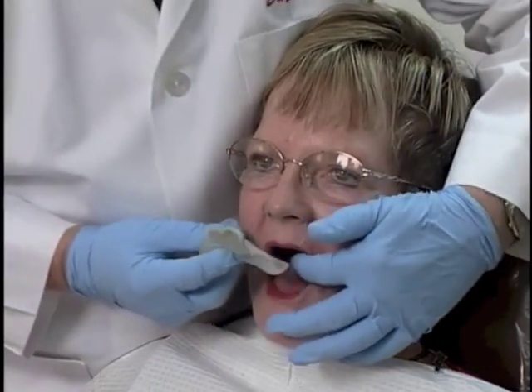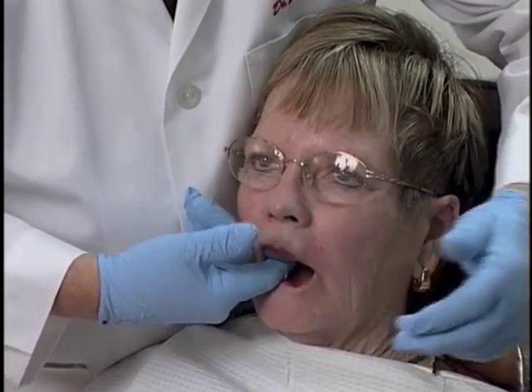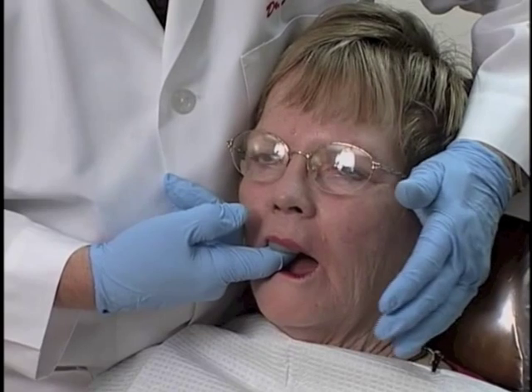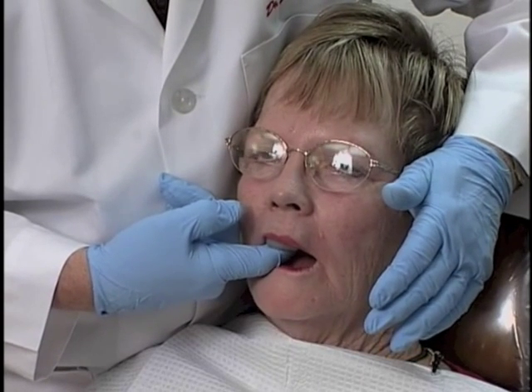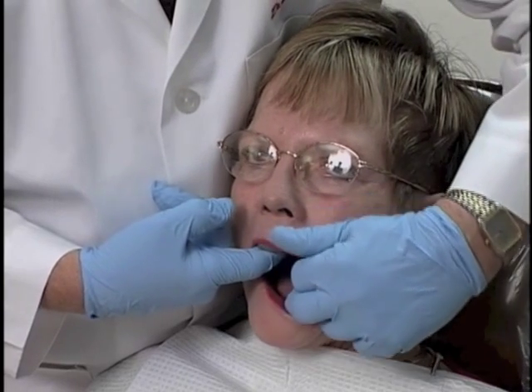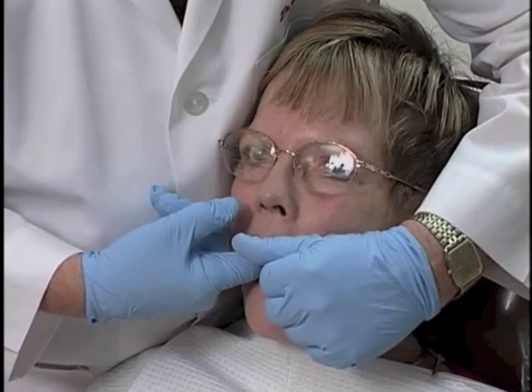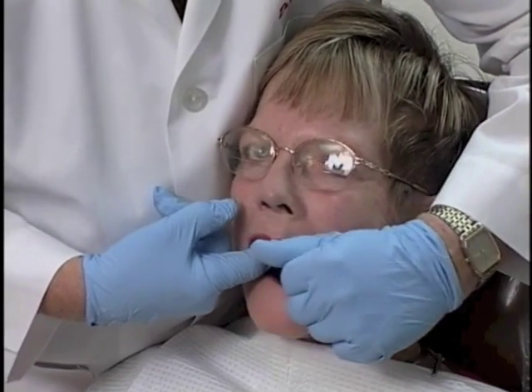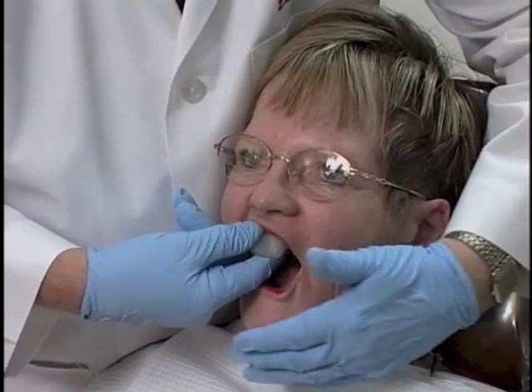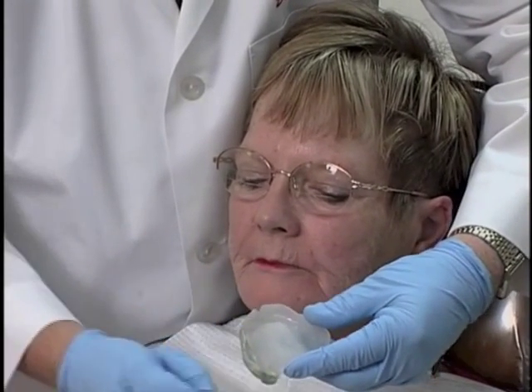When the material is thoroughly softened, we're ready to go to the patient's mouth. So we rotate the tray into the patient's mouth, make sure it's seated all the way. Then we ask the patient to move their chin from one side to the other. Then once that's done, we grasp the cheek like so and pull it out and down and anteriorly and posteriorly. And once that's done, you'll see that we have border molded one section of the tray.